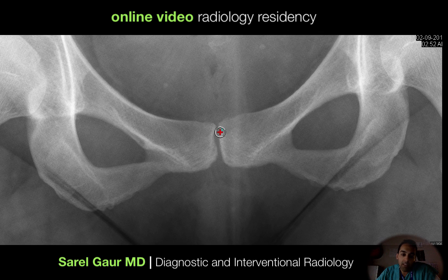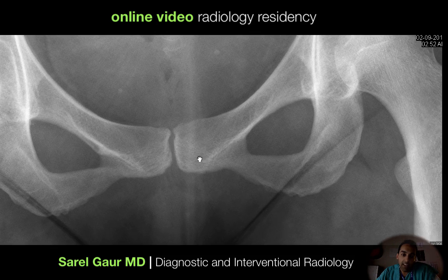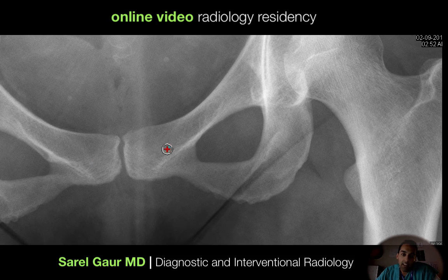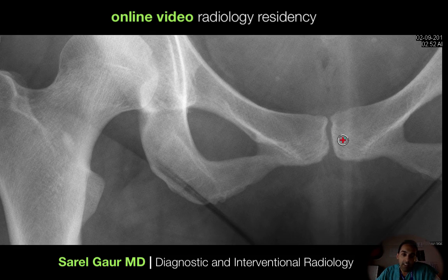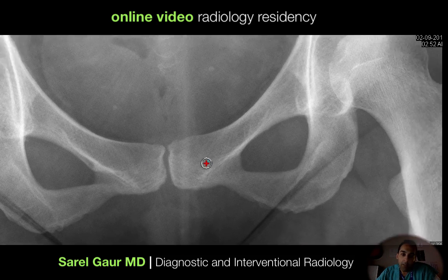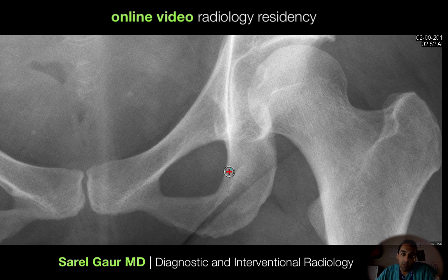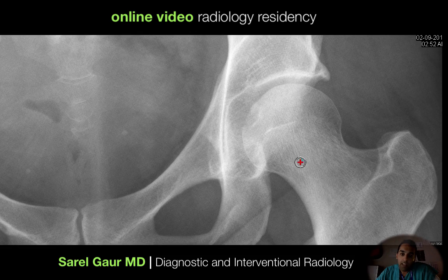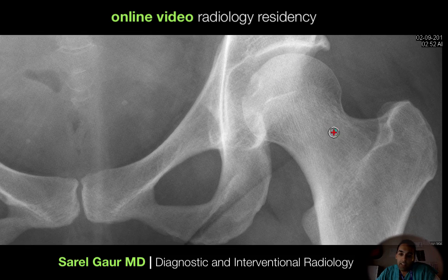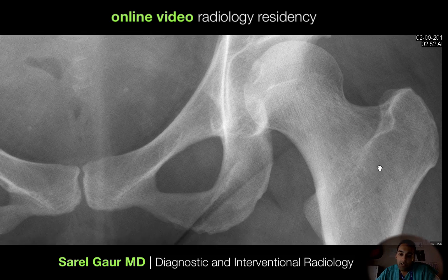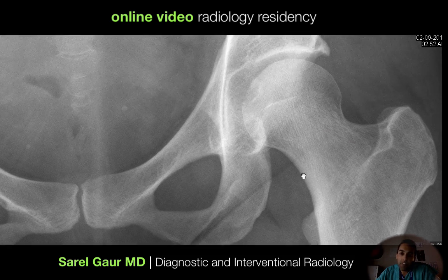Moving on from the pubic rami, I come to the symphysis pubis. In traumatic injury, I can have widening of the symphysis, so I'm looking for that. Then I do the same thing on the left side — going through the superior and inferior pubic ramus, the ischium, looking at the femoral head, femoral neck, the intertrochanteric region, and the subtrochanteric region.